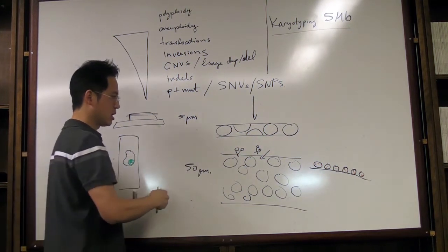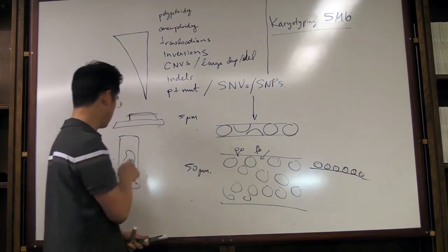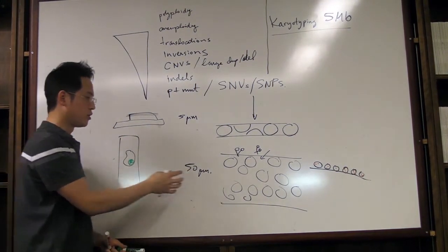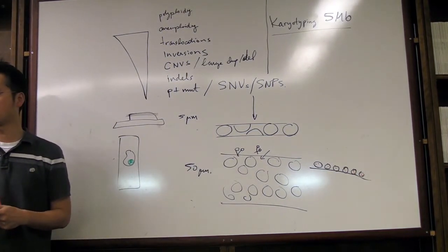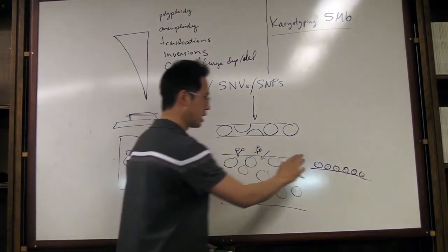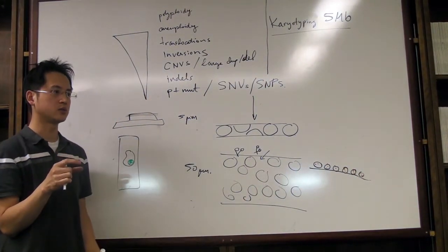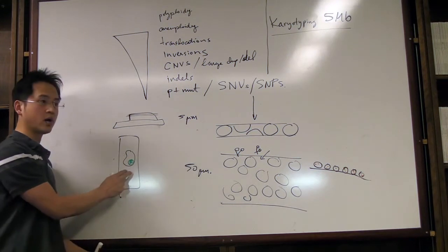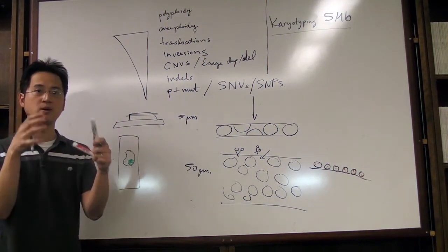What happens in this case, if you muck up everything and blend it together, is you lose this architecture right here. In order for you to do this method, you really have to rely on very high tumor cellularity samples so that in the end, what you're looking at is mostly tumor, and maybe a very minor fraction of it is normal cells. But if you do it this way, you do a section through here, but you don't move the cells around, you keep them in place.